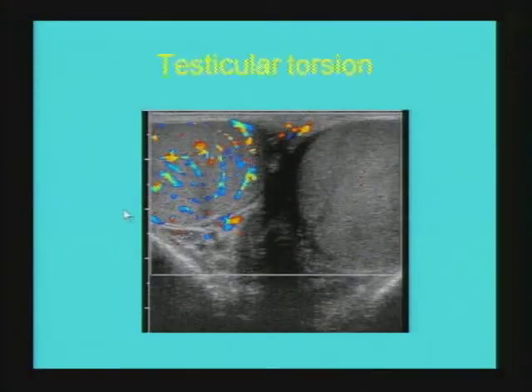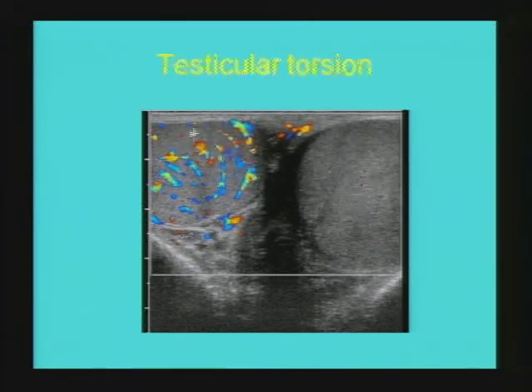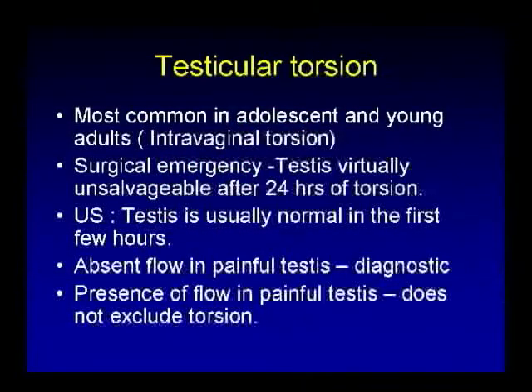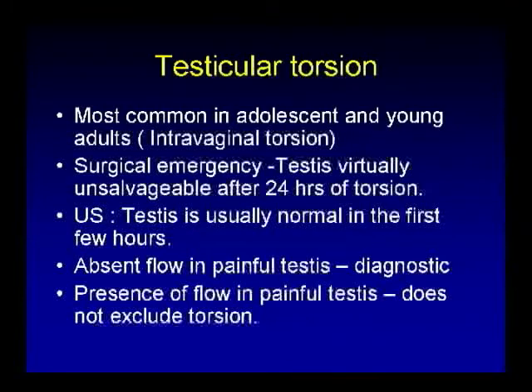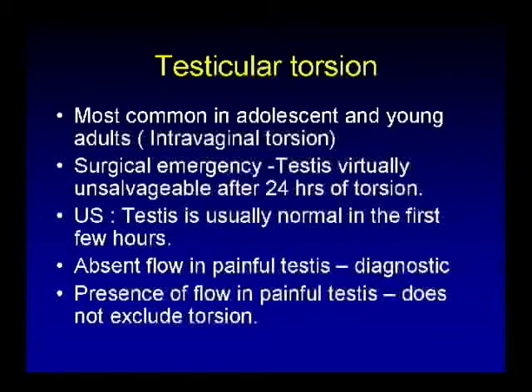Another acute condition is testicular torsion, the second most common cause of acute scrotum in children. This ultrasound shows transverse images of bilateral testicles with color Doppler evaluation showing normal flow in the right testicle and absence of flow in the left, which shows minimal heterogeneity of echotexture and diffuse enlargement. Testicular torsion is a condition of adolescent and young adults; most cases are intravaginal torsion. It is a surgical emergency, as salvage depends on duration of torsion, and after 24 hours the testis is almost unsalvageable. Absence of flow in the painful testis is the criterion for diagnosis.